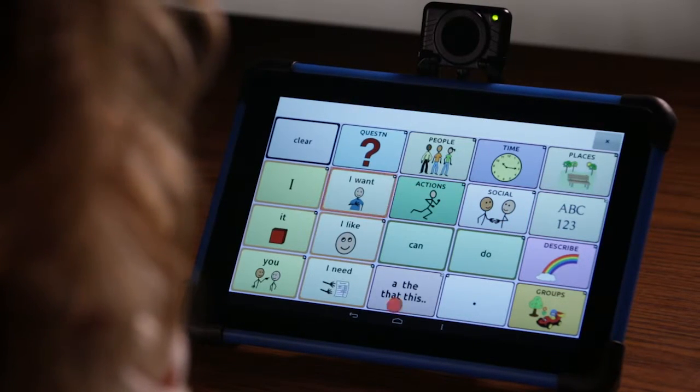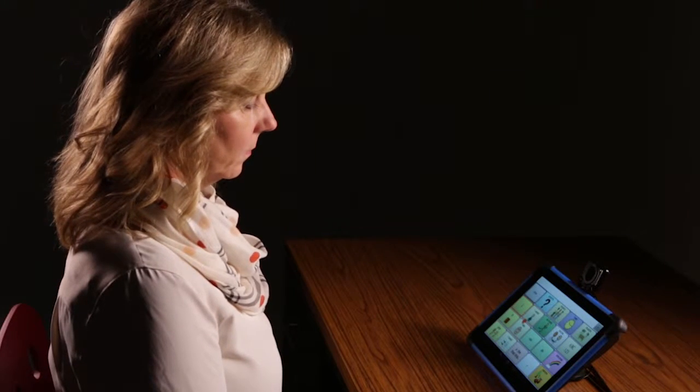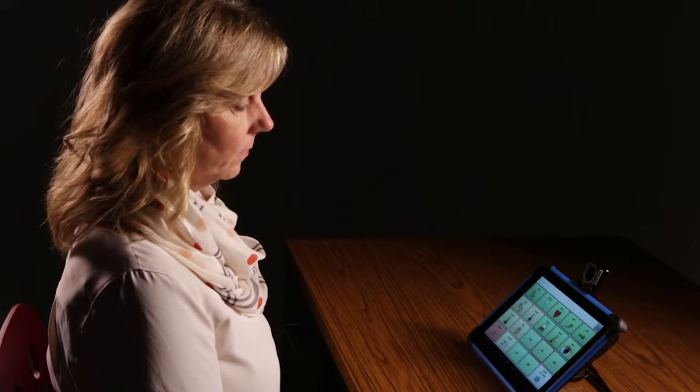This example uses large vertical and horizontal values. This example shows small vertical and horizontal values.